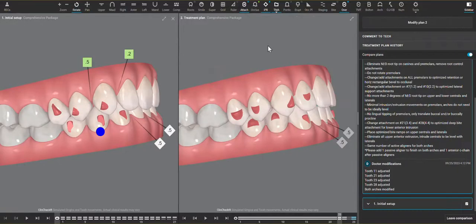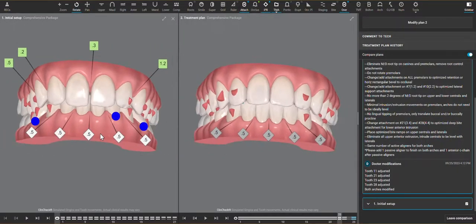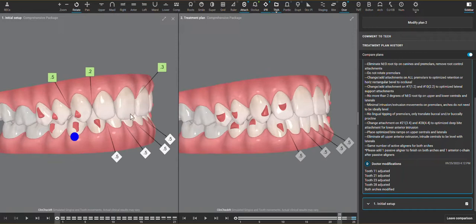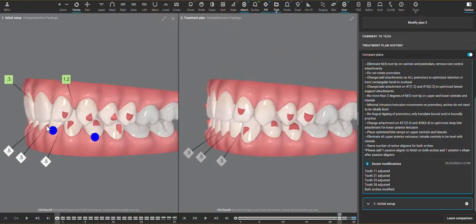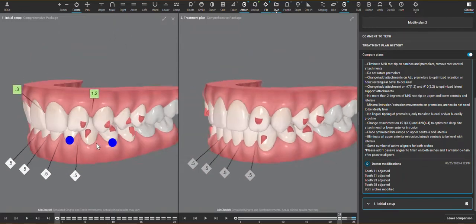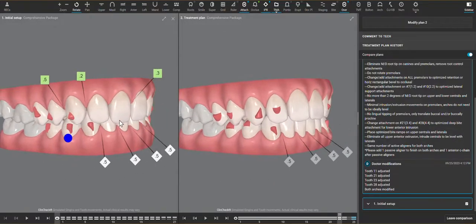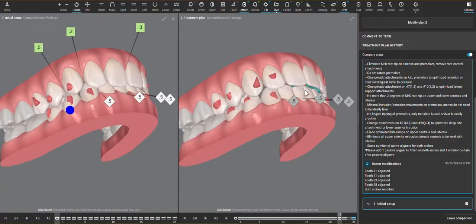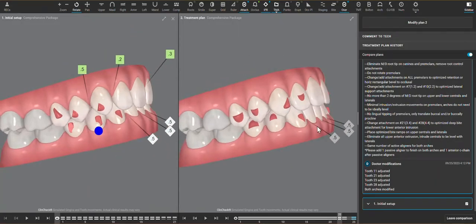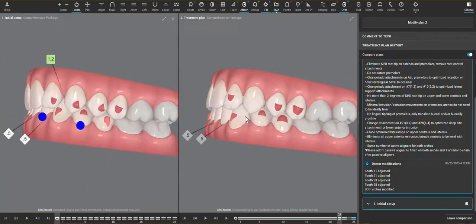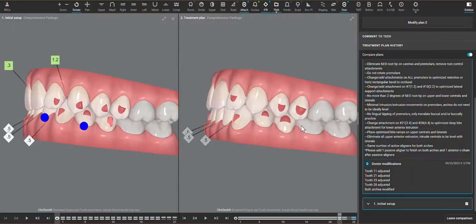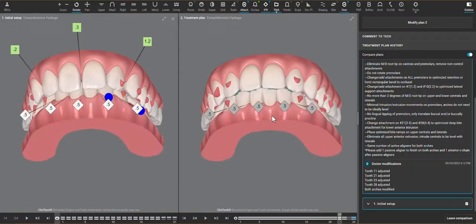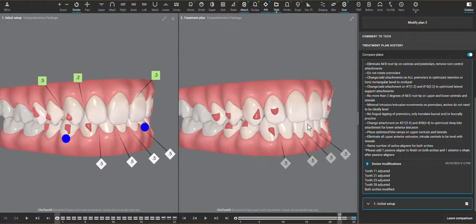Looking at a similar case, more of a deep bite, still more lower crowding than upper crowding and having more lower crowding than upper crowding tends to be really tricky. And if we can't find a way to get the teeth to fit in with each other without some IPR, then this would be one to refer. But fortunately, because the patient isn't very class three and really just has some undersized laterals, this is something that can be addressed.